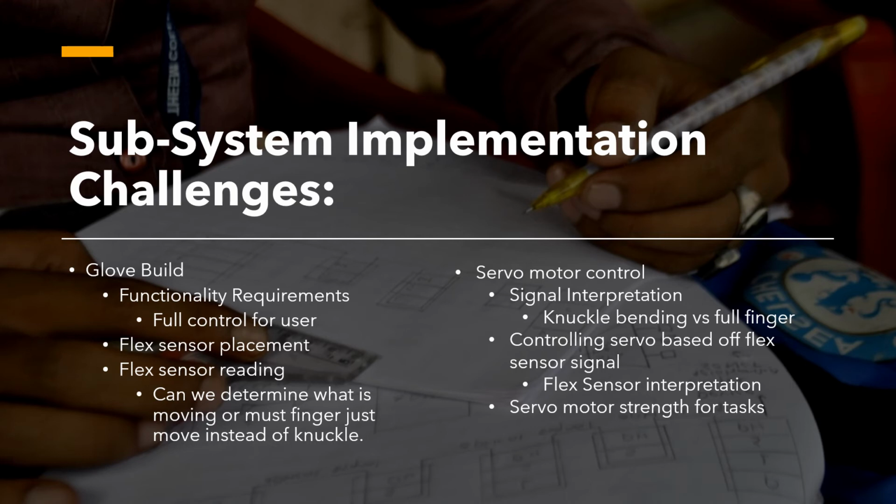Another thing to keep in mind are the servo motors in the prosthetic arm, how we're going to adjust the finger due to the movement of the flex sensor in the glove, and how we're going to adjust those servo motors within the prosthetic arm.